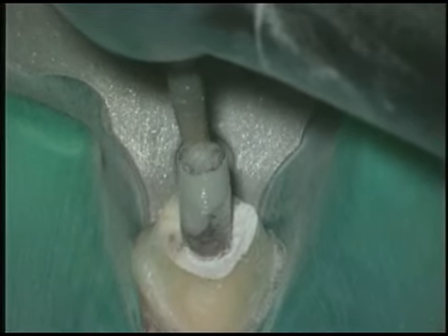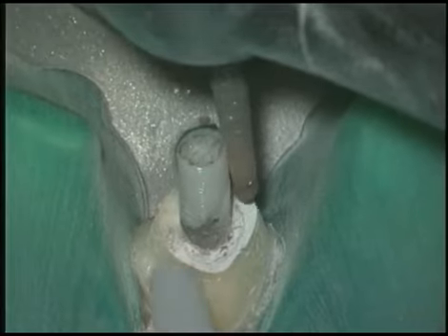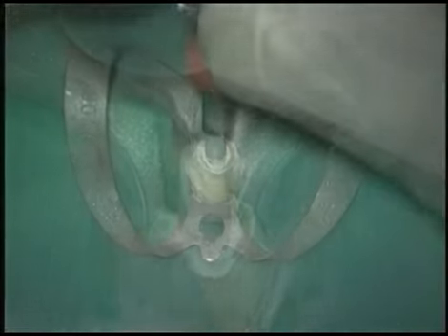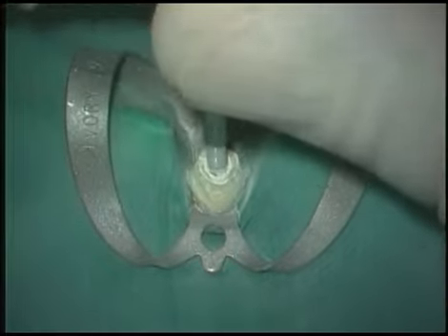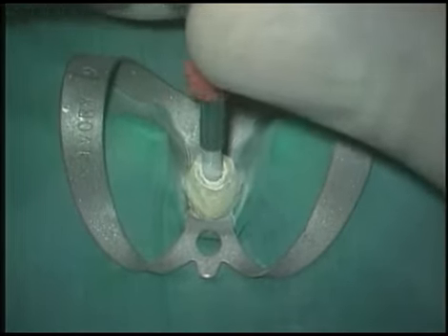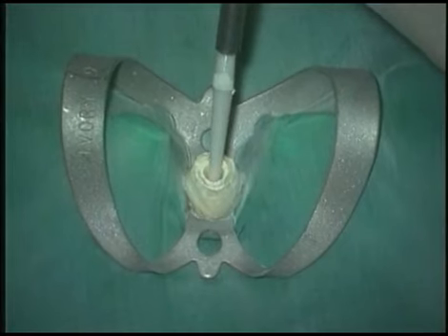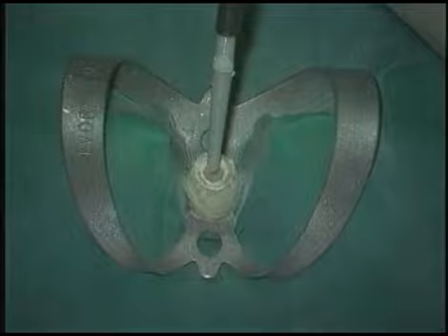I'm using the diamond to machine down the top of the post, intentionally without water, to show you how hard these posts are. Without water, notice the sparks. We can still tap these non-metallic posts. The tap engages and is drawn down, and the post begins to move. Without using the extracting plier, the post is elevated out of the canal. Looking ahead to the future, adhesion dentistry and fiber posts will be a formidable challenge.